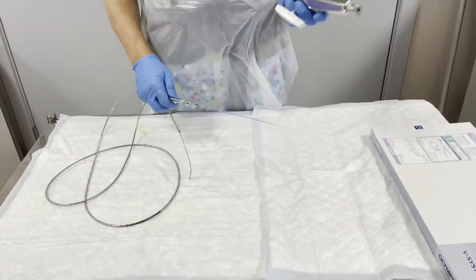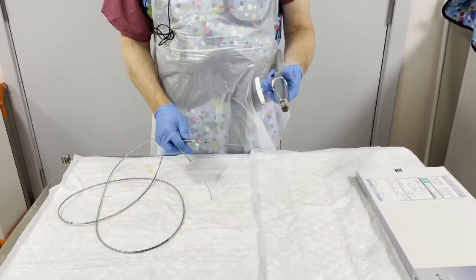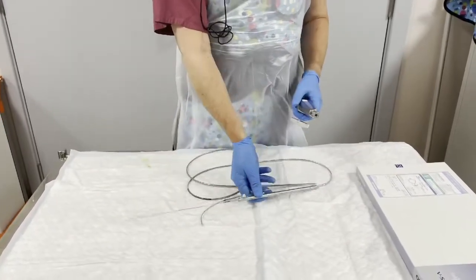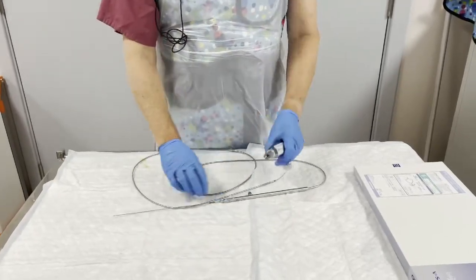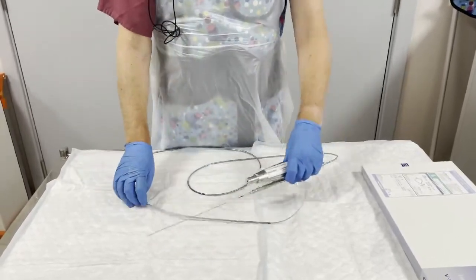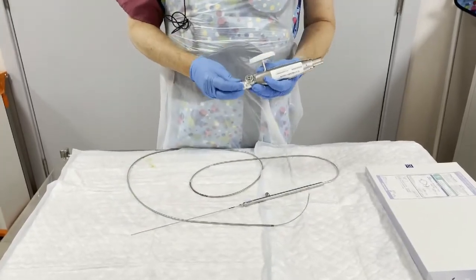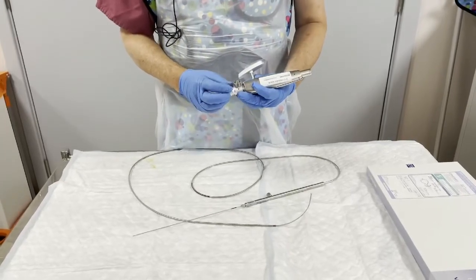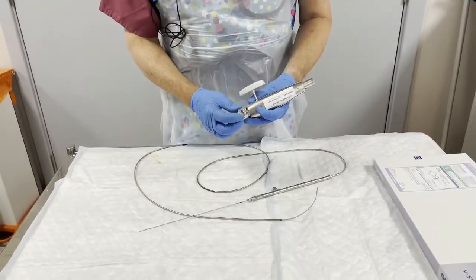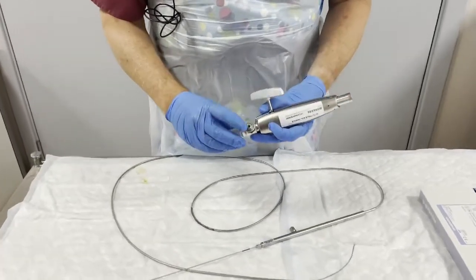Now it is possible to put this together completely incorrectly such that the whole thing falls to pieces when you actually use it. The first thing to say is that on the handle, you need to be sure that the lock is completely unlocked, so that's anti-clockwise torque.